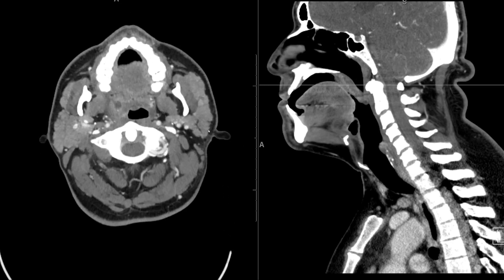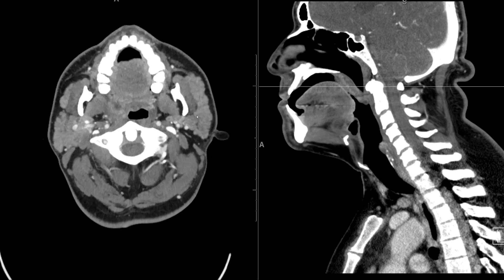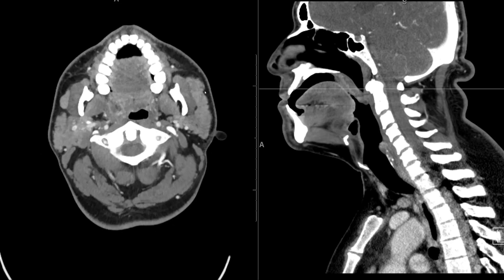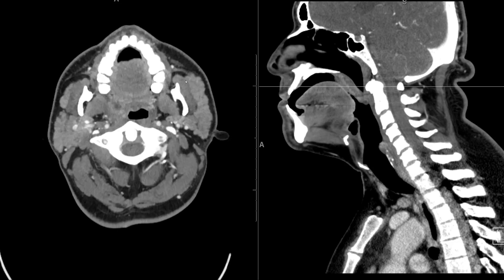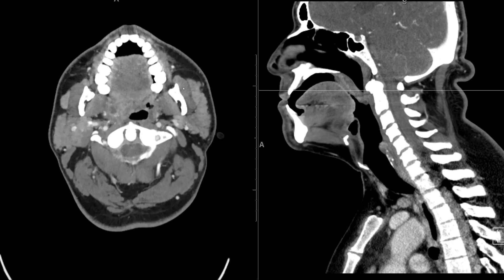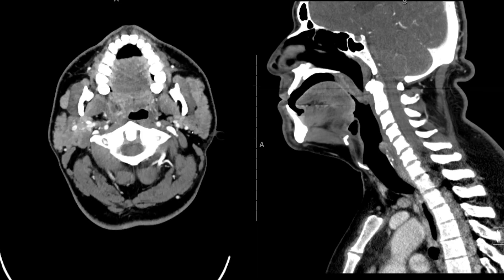The first and largest gland is the parotid gland. You can see that the parotid gland in this patient is very lobulated, which is normal, and it has quite a bit of extent anteriorly over the masseter muscle. This is a contrast-enhanced CT scan, and it's different from the muscle — more lobulated and located mostly posterior to the masseter muscle.